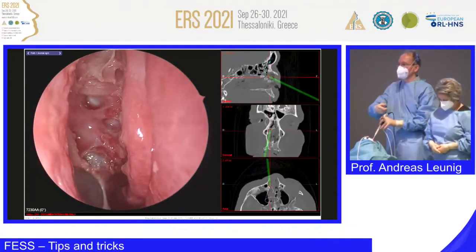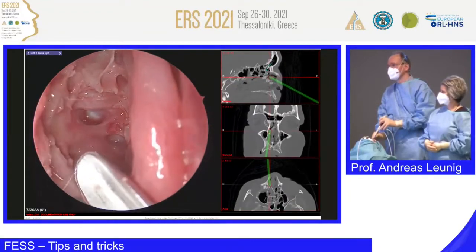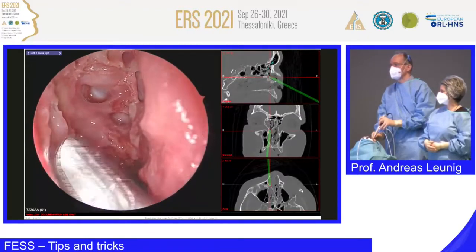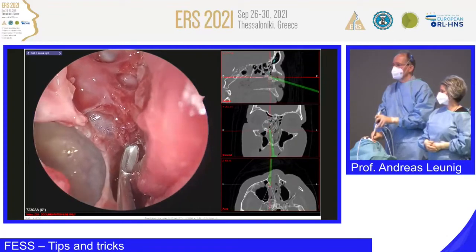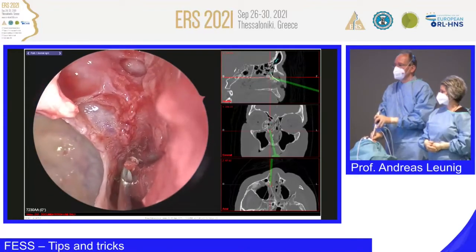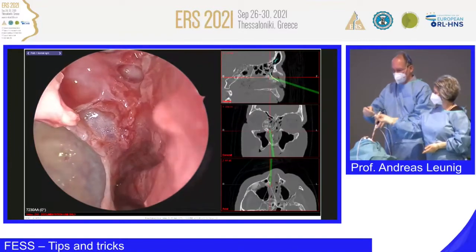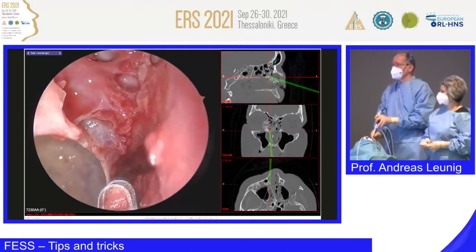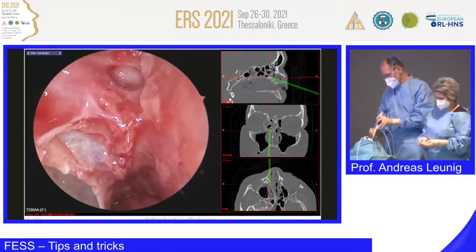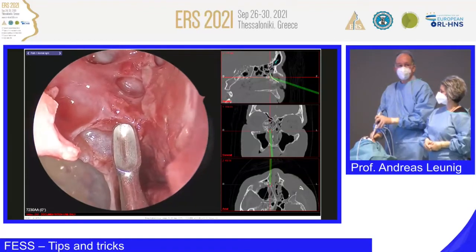So we have the basal lamella here, the first one, from the uncinate process. And we have here the second one from the ethmoidal bulla. And where do we have the basal lamella, the attachment of the middle turbinate at the lateral nasal wall? It's here. We are following the horizontal posterior part of the middle turbinate, and we are looking where this anatomical structure is going from horizontal to vertical and coming up. And this seems to be the ground lamella of the middle turbinate.